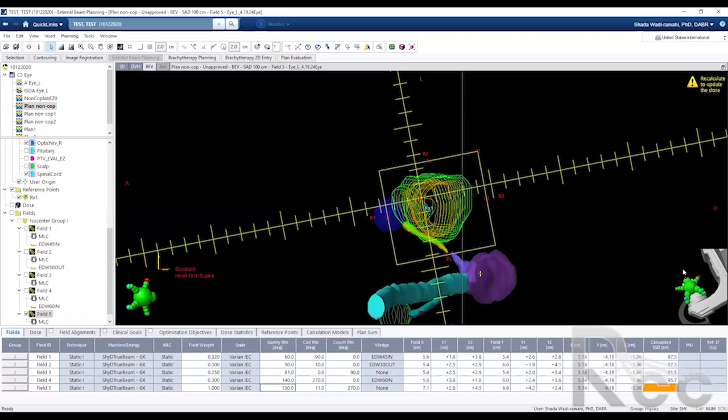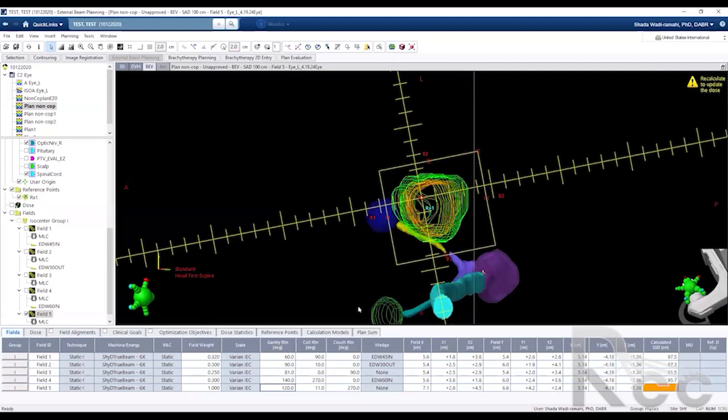Now, luckily, modern day linacs have collision alert, whether you're using Elekta or Varian or maybe other vendors. When you go and actually deliver the plan, it will tell you it cannot go further. The collision interlock will be activated and everything stops. But in the planning system, you don't see that. If I want to go ahead and calculate it, it will give me what I ask it to give. So remember, computers, while they make our life easy, they're not smart.